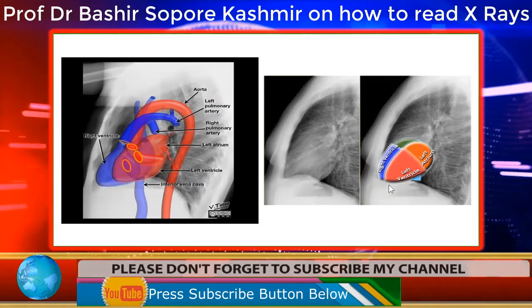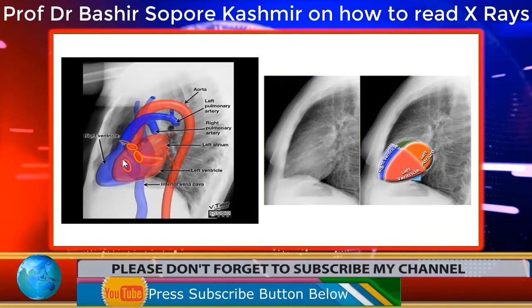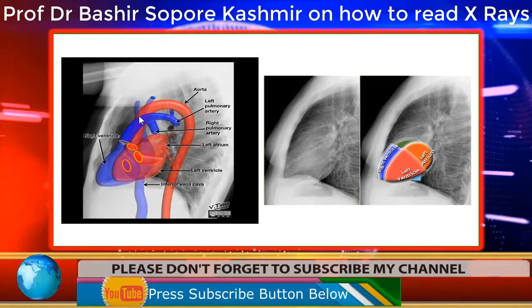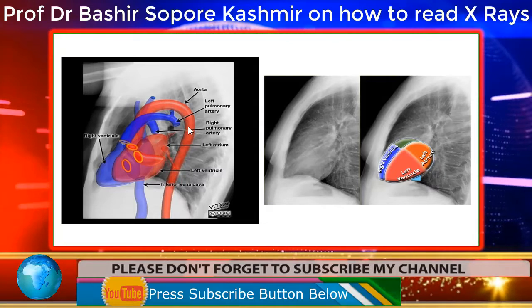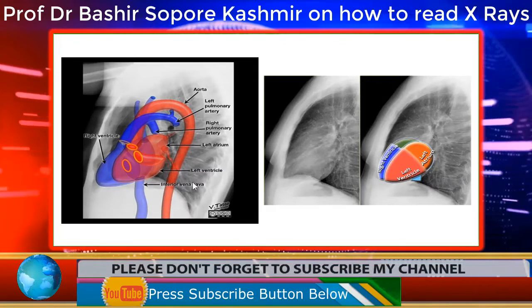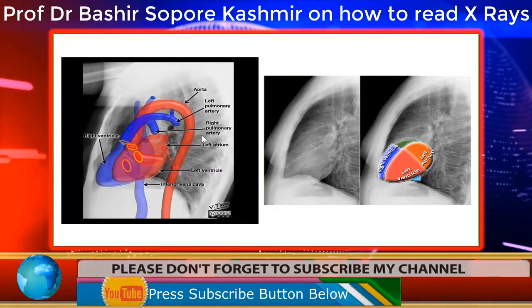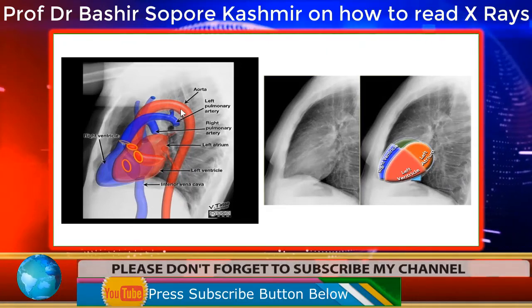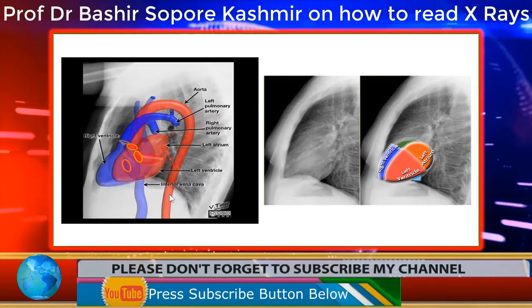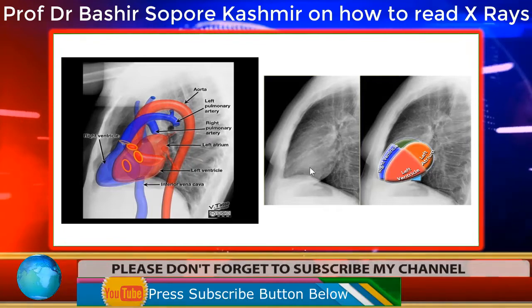And on the lateral side, you can see this is the heart on the lateral side. This is the left ventricle. This is the right ventricle. This is the arch of aorta. And then this is the descending aorta. So descending aorta goes in front of the spine. This is the spine. You can see the intervertebral spaces here. So in front of this is coursing the descending aorta.